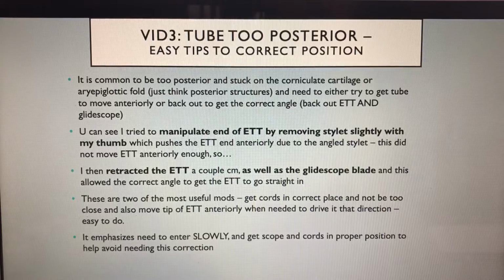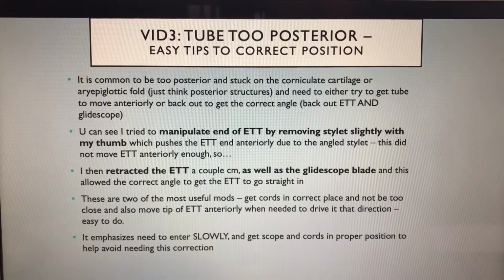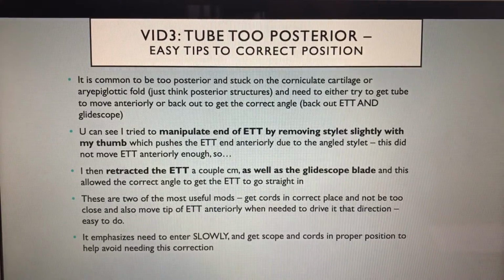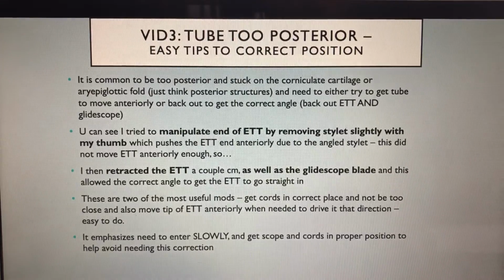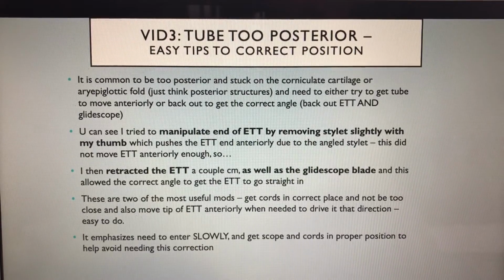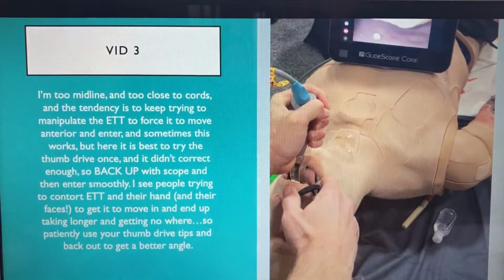Now it's going to be really common to be too posterior and you're stuck on the corniculate cartilage or the aryepiglottic fold, any of the posterior structures. You're trying to get the blade in or the tube in, and you're going to contort your mouth as well as the tube in much different ways to try to force it up there, and it just doesn't work. There are some things that you can do that are very simple that will help get it into the right place. One of the most important things is just to back out sometimes.